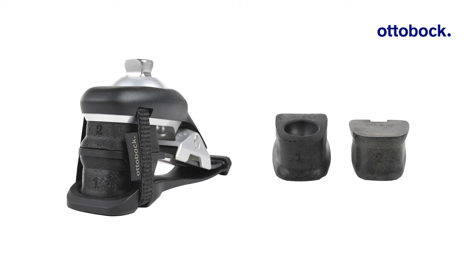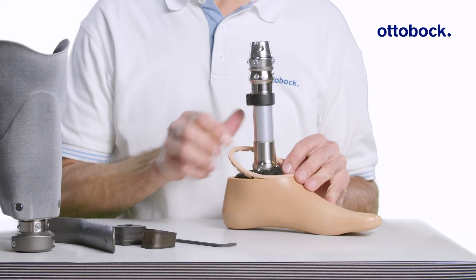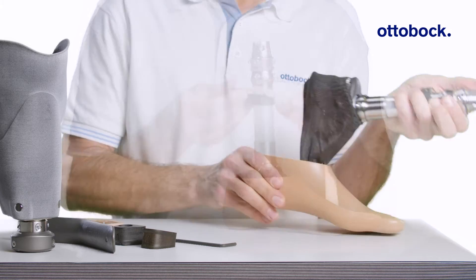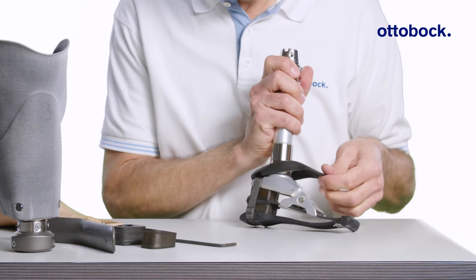Changing the foam wedges is easy and fast. First, remove the foam cosmesis adapter plate, footshell, spectra sock, and black cover on the top of the foot module.